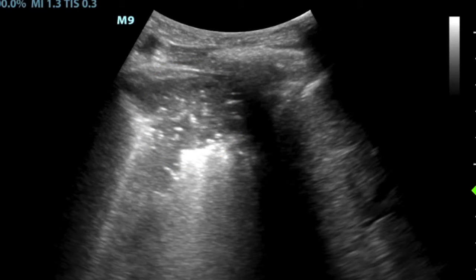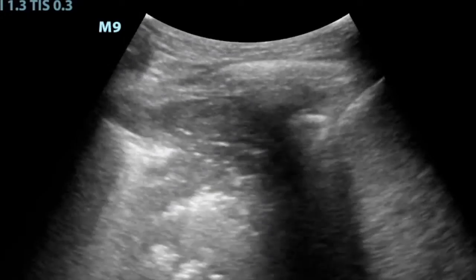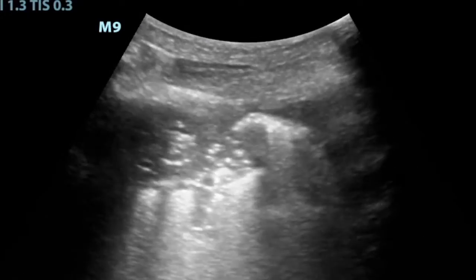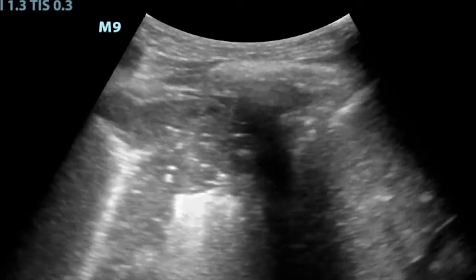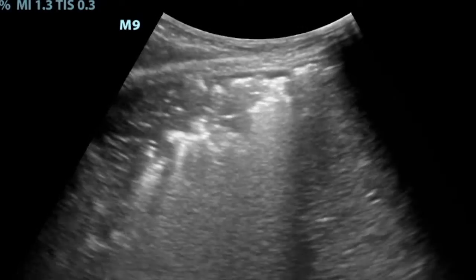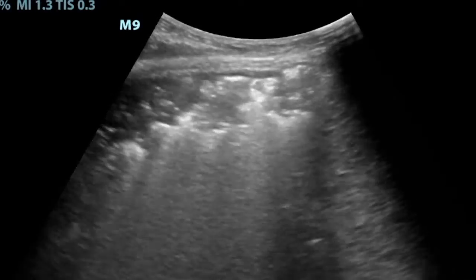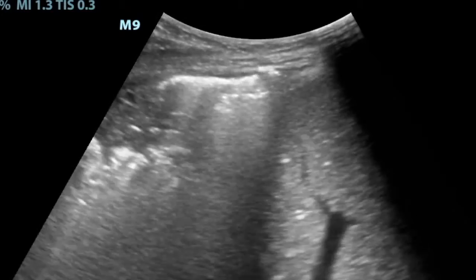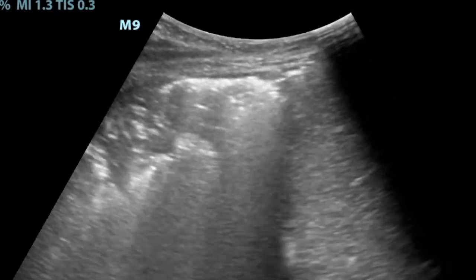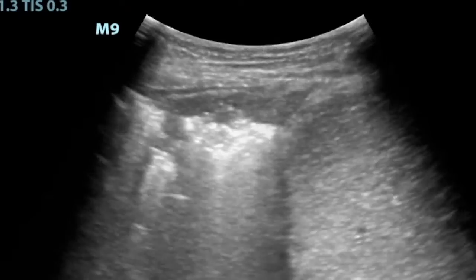This type of image arises because liquid-filled or collapsed alveoli no longer have air in them, and the remaining gas is in the bronchial tree. This produces what are called air bronchograms. On an ultrasound, air bronchograms look like a starry night sky — these very hyperechoic dots and lines that we see here.